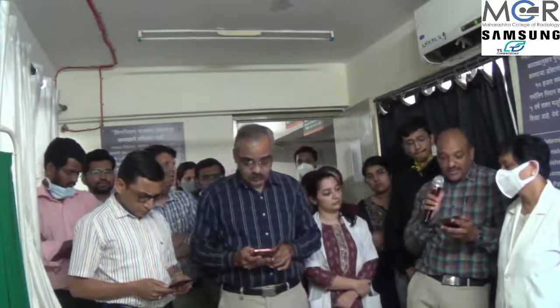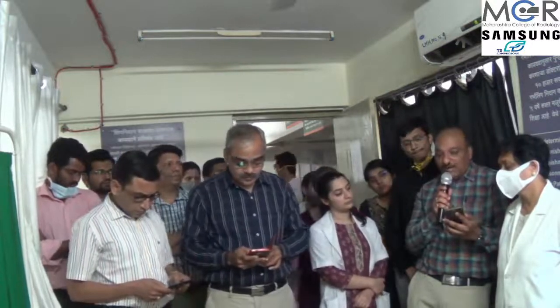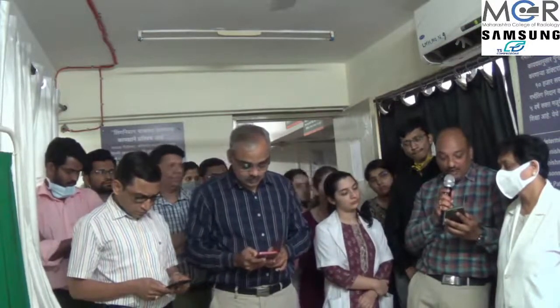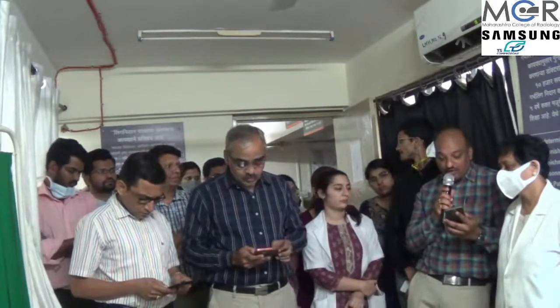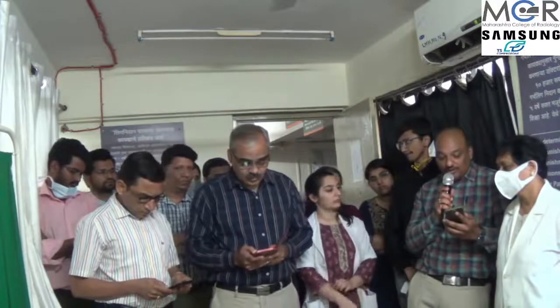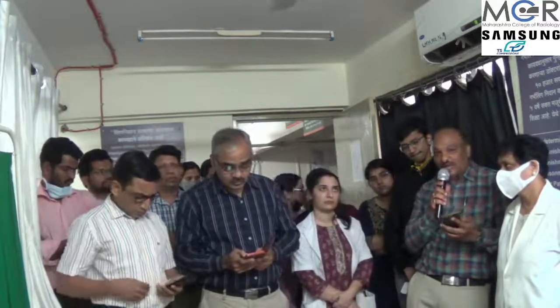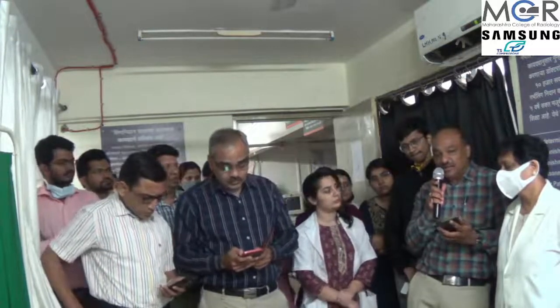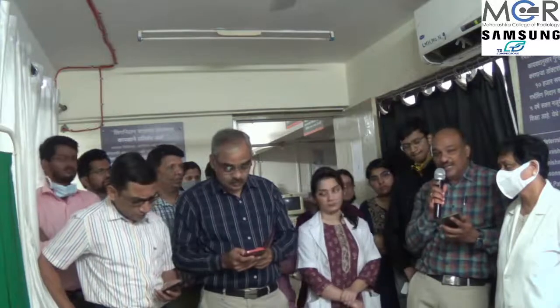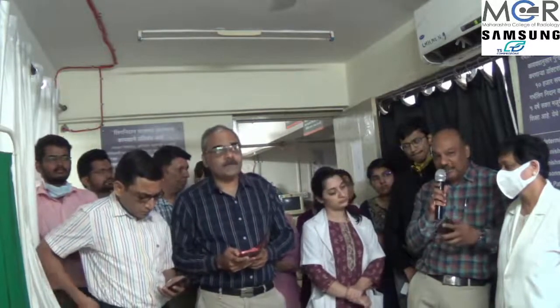Then another question is, in ovulation study if the dominant follicle doesn't rupture by day 20, for how long should we continue the study to look for rupture and if a follicular cyst is formed, when to reassess, and how to measure the endometrial volume. Basically, if a dominant follicle is not rupturing after day 20, it is becoming a retention cyst or unluteinized cyst. In these cases, we have to leave this study and ask this patient to come in another cycle.